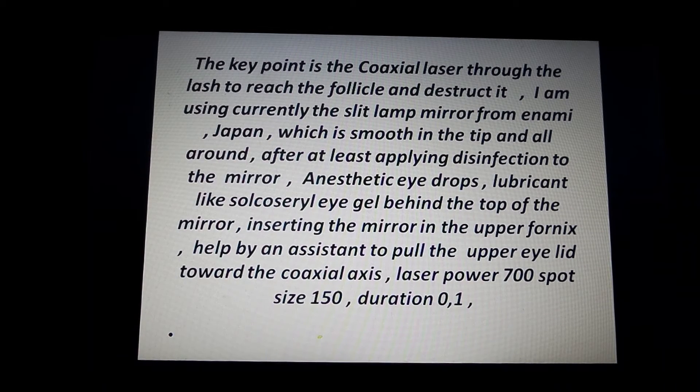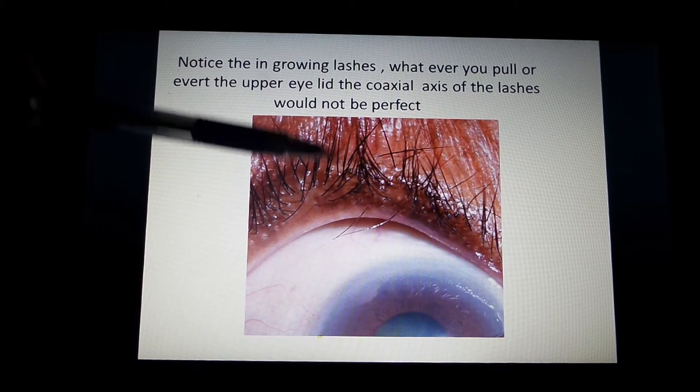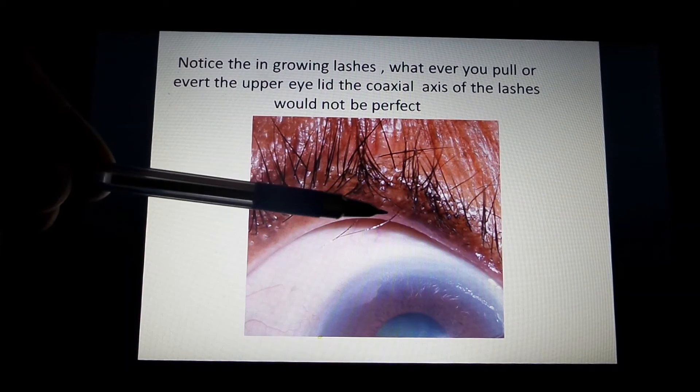The laser parameters I use are: power 700 mW, spot size 150 microns, and duration 0.1 seconds. Notice the ingrowing eyelashes here — lash 1 and lash 2.